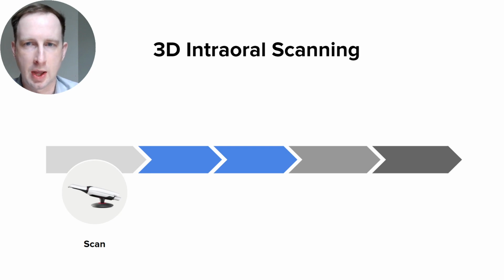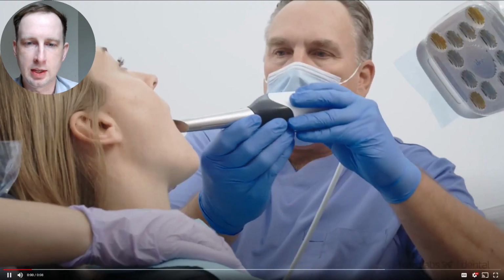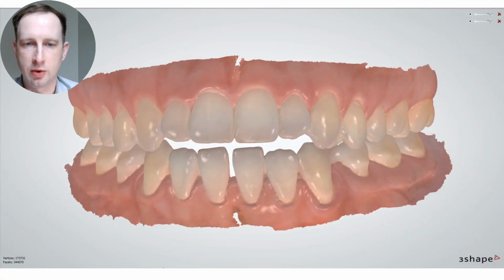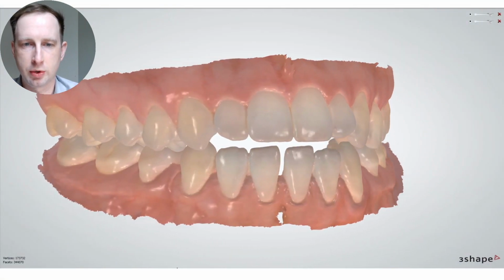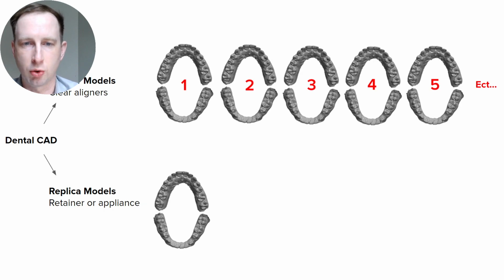And so, like I mentioned, this is going to be going through how to thermoform a clear aligner or retainer end to end. And so to start with 3D intraoral scanning, it's an important point with digital impressions that you want the files as an STL file, and this is an example of what it would produce. This is actually off of a 3Shape Trios, and once you have that digital impression as an STL file, you're now ready to move into the CAD process or preparing it.